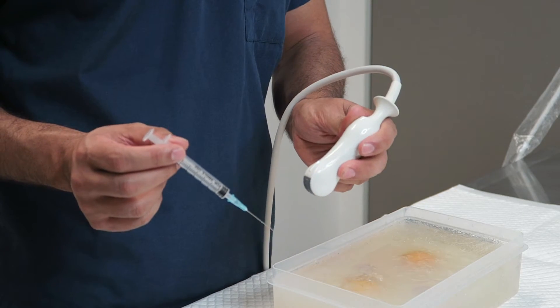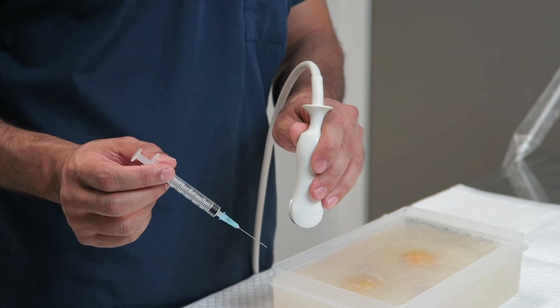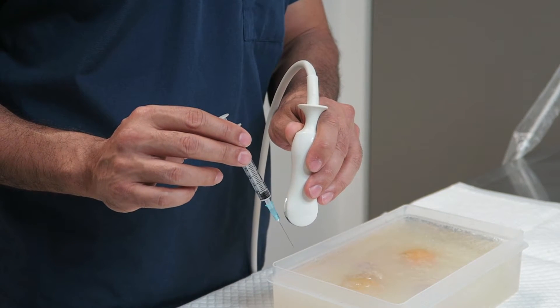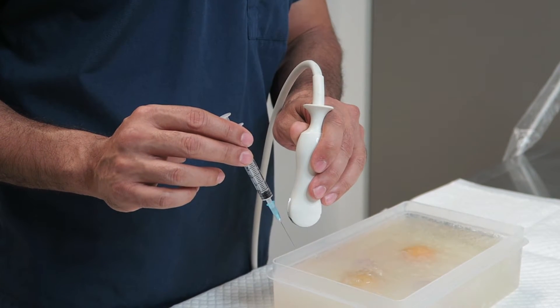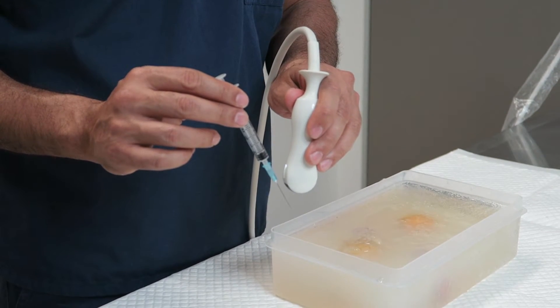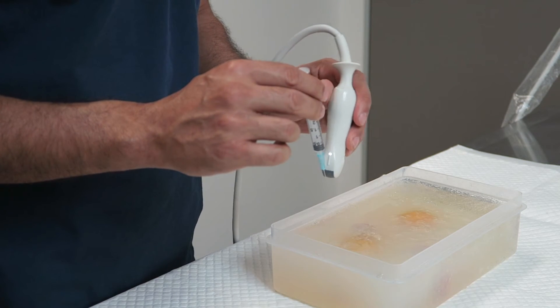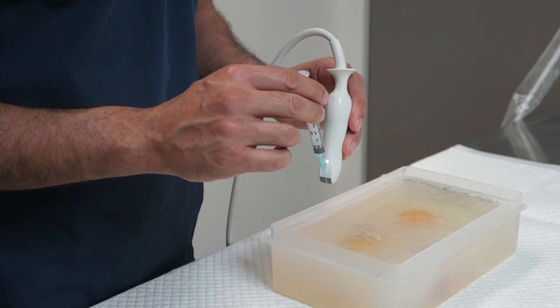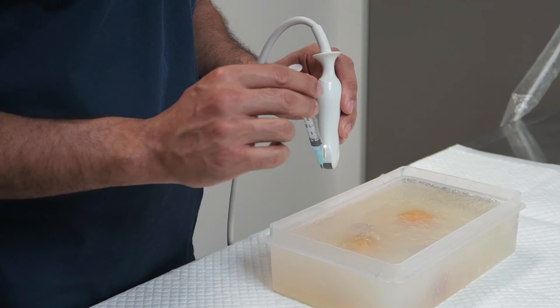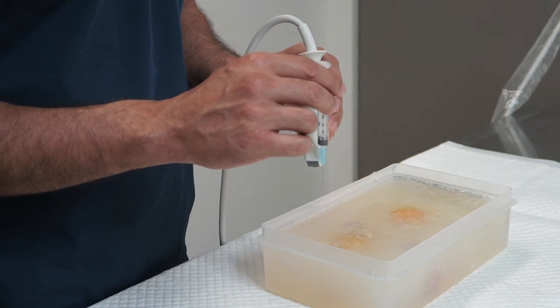The third tip is troubleshooting when you've lost your needle. You've placed your probe, located the area of interest, and inserted your needle, but you can't see it on the ultrasound screen. The safest thing to do is to fan your probe in order to locate the needle tip, as opposed to actually moving your needle, as this can cause pretty significant trauma on the inside.